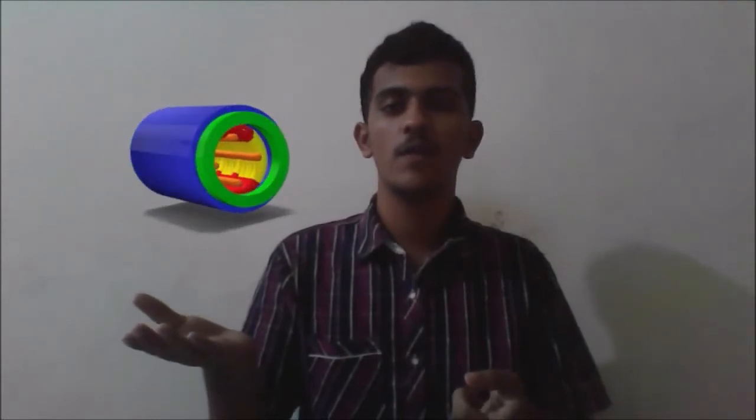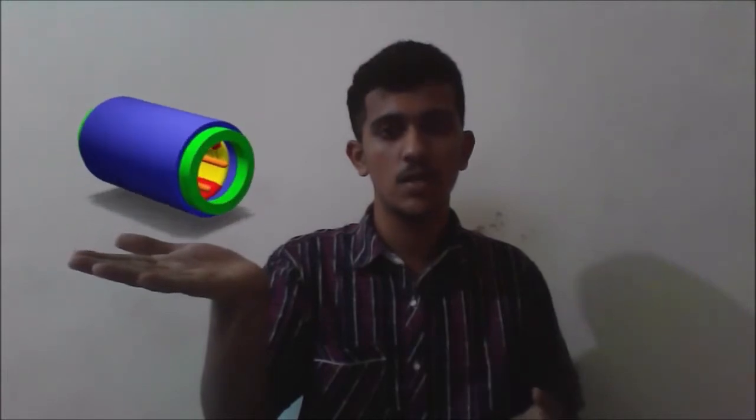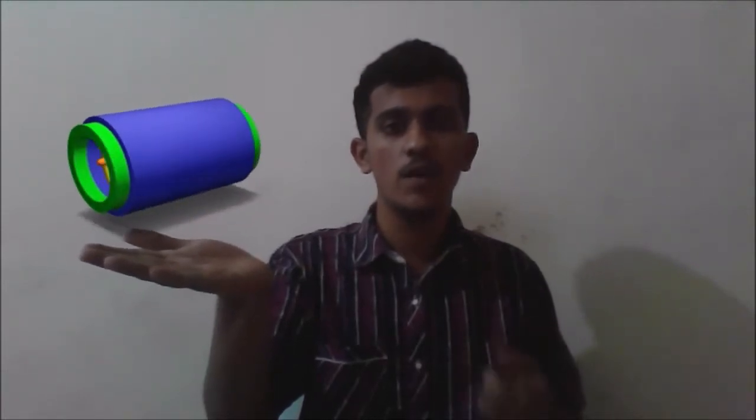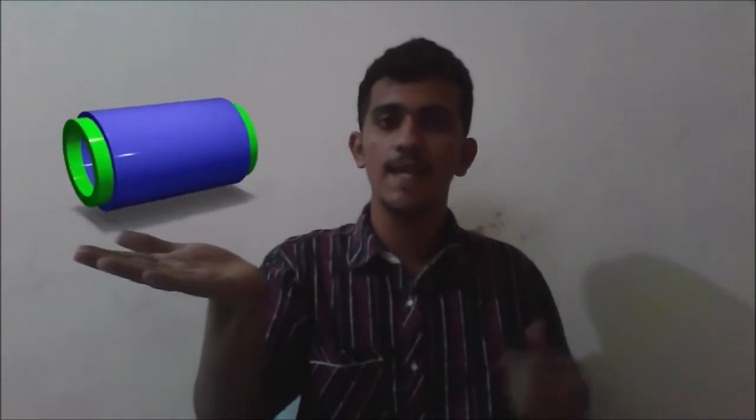The green coils are also gradient coils, which allow us to take images along the z-axis. Further, the orange colored rods we see running along the cylinder are radio frequency coils. They are responsible for triggering the antiparallel, parallel alignment of the hydrogen atoms along the magnetic field. How? Let's see.